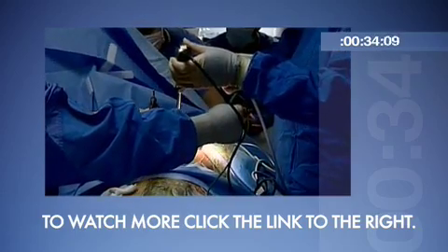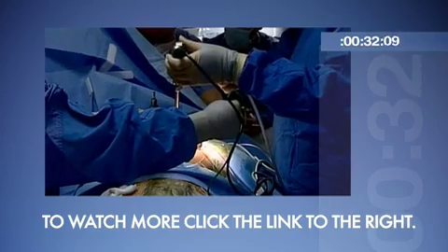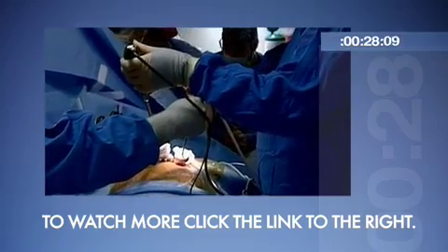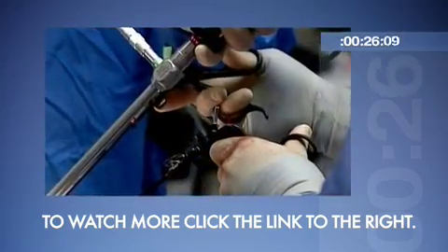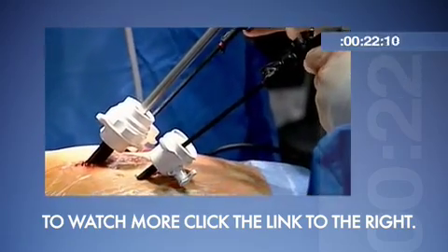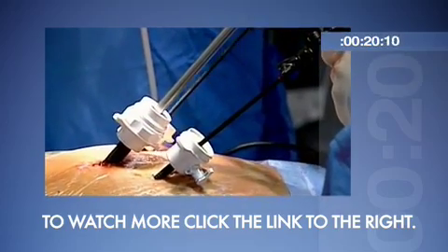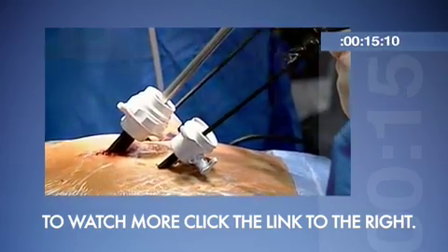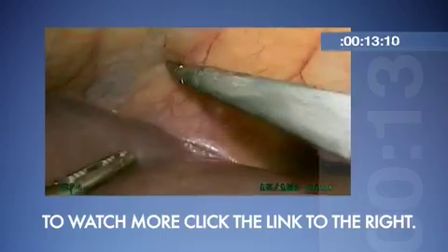As you can see here, the camera allows me to visualize the heart endoscopically, and the instruments are very small — just normal endoscopic instruments that we use to open the diaphragm. We use a Carl Storch camera because it allows us to see high-definition images and also eliminates a lot of the risk of injury to the heart during the procedure.